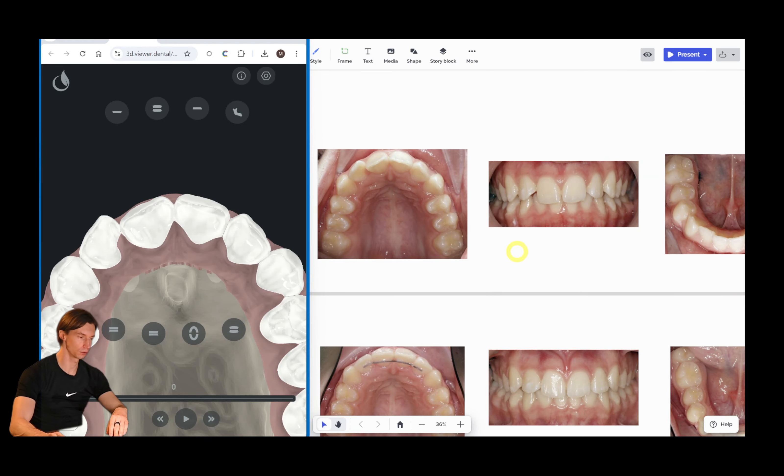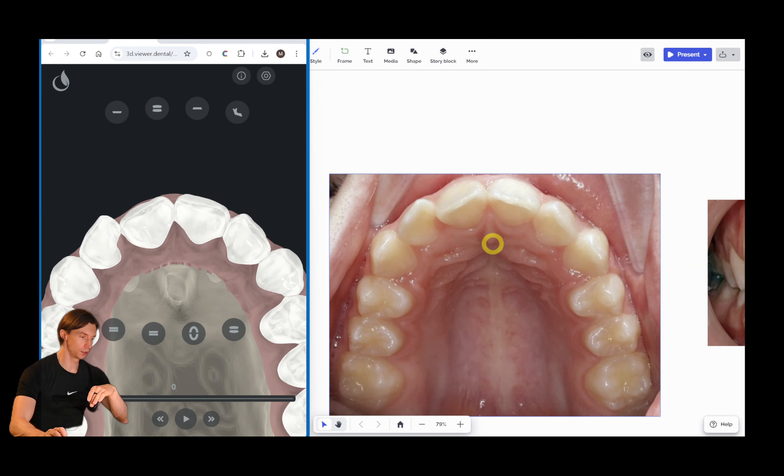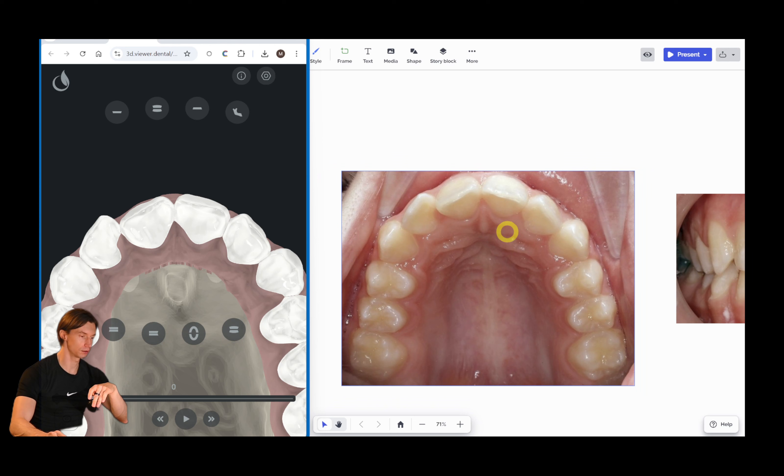Let's study another case which was finished by the doctors I work with, printed in my lab, and designed by me. This is the initial position of the teeth, and let's see how the setup looks.